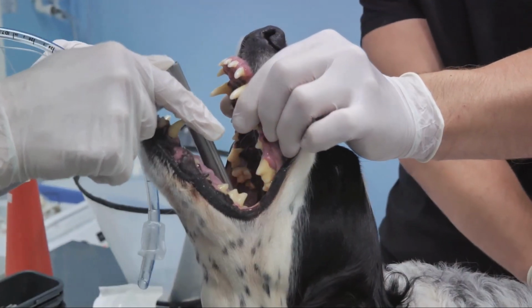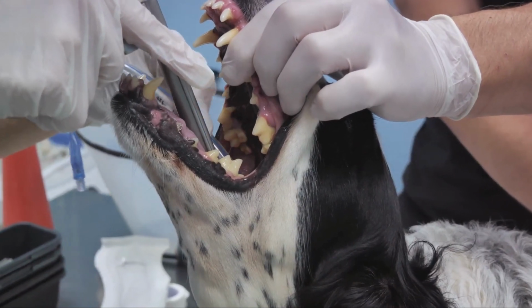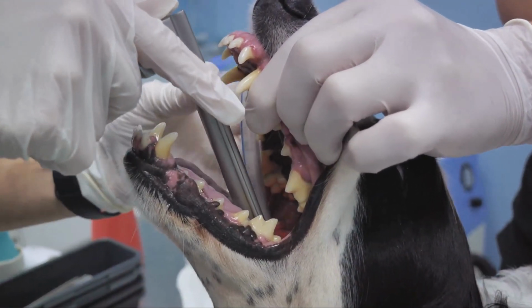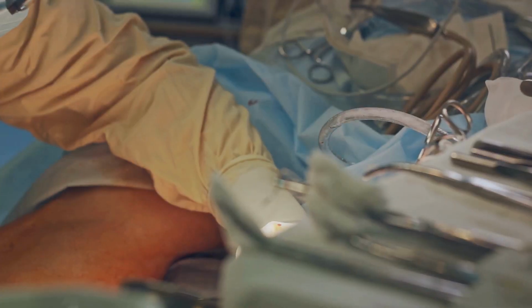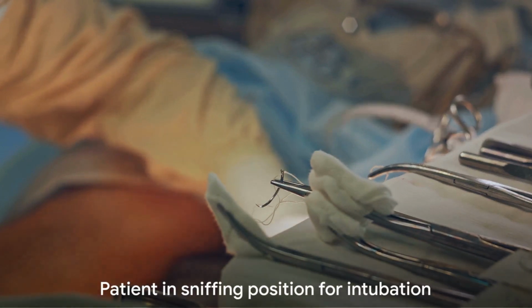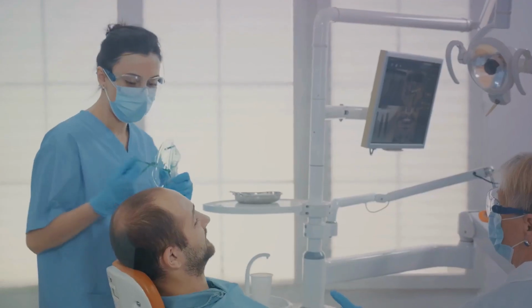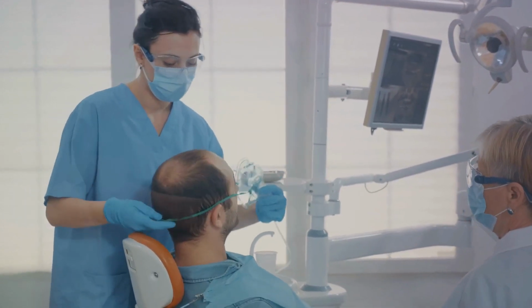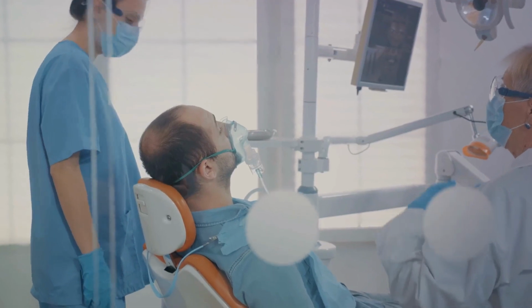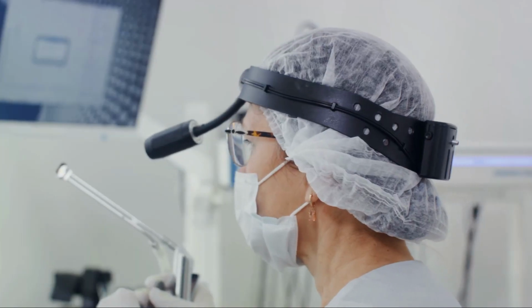Let's begin with nasotracheal intubation through direct laryngoscopy. This technique is commonly used in anesthesia and emergency medicine for securing the airway. The necessary equipment includes a laryngoscope, a nasotracheal tube, a stylet, and a suction device. First, the patient is placed in the sniffing position, which aligns the oral, pharyngeal, and laryngeal axes to facilitate intubation. The nasotracheal tube is then prepared by lubricating it with a water-soluble lubricant to ease the nasal passage.